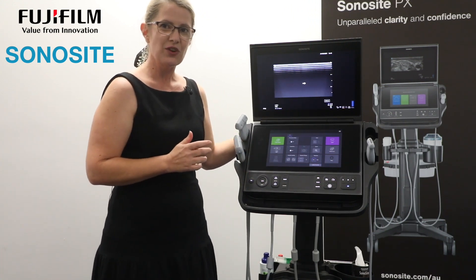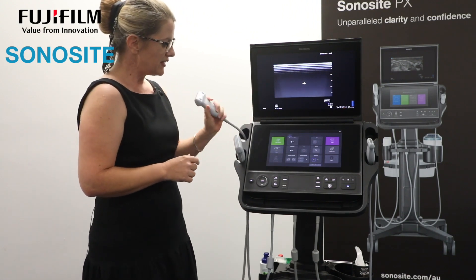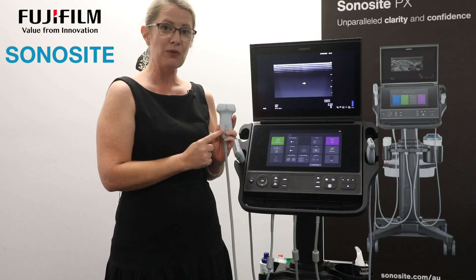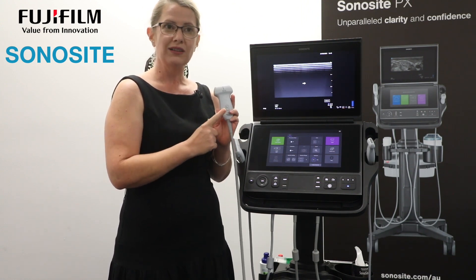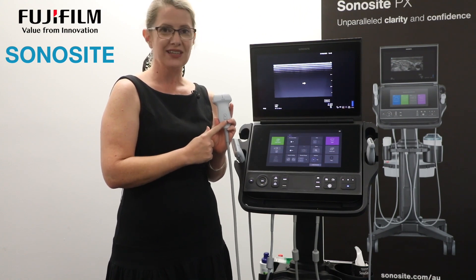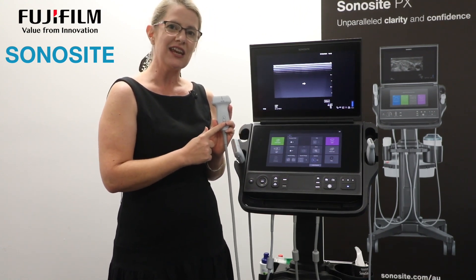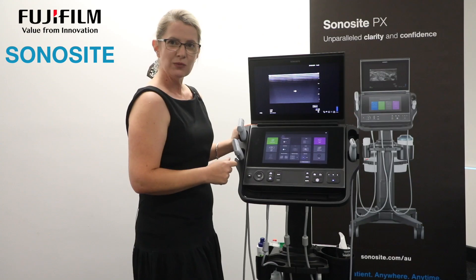Where we've taken this further is with new technology in our completely new suite of transducers, particularly our Spotlight probes. The hybrid linear L12-3 probe allows for lovely image clarity with a scan depth to nine centimeters without losing that clarity in the superficial viewing field.